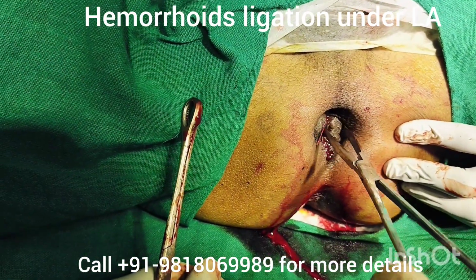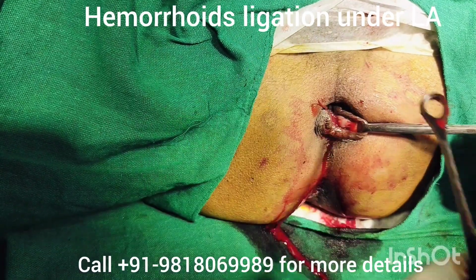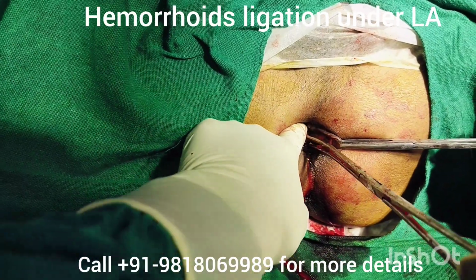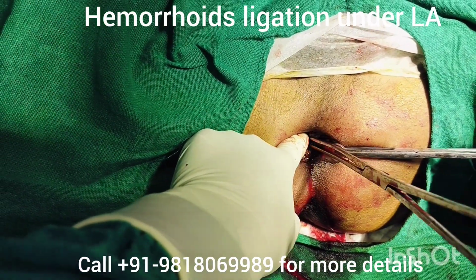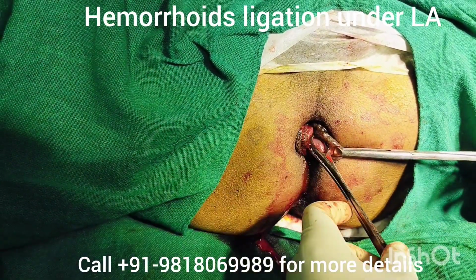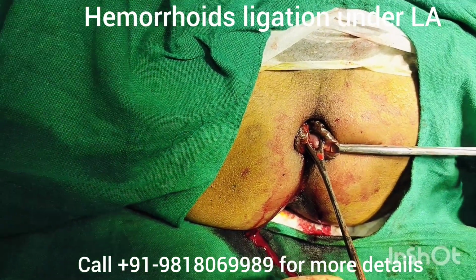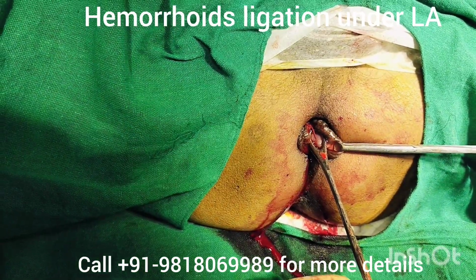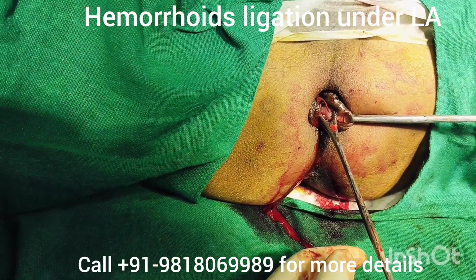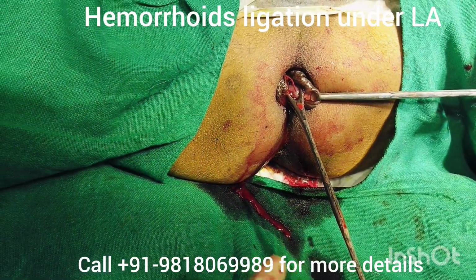Application of Allis forceps, and then holding of pile mass at 3 o'clock position. This pile mass will also be transfixed and ligated in the same way as we have done for 7 o'clock position and 11 o'clock position.